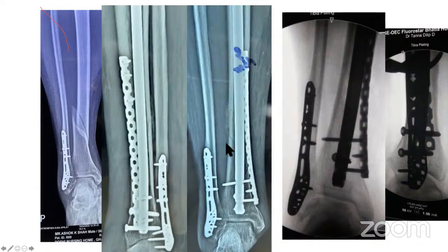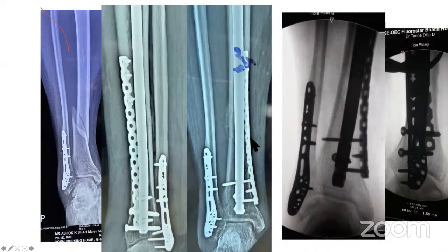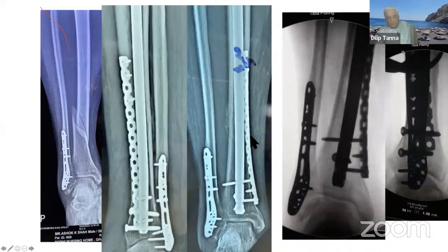Recon plate is added in this case, sir. Recon plate is added in this case. It's a reconstruction plate. And it was done in a MIPPO mode. So I feel maybe this was an overkill.